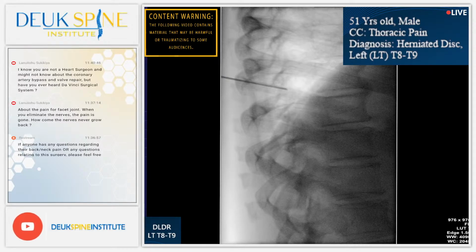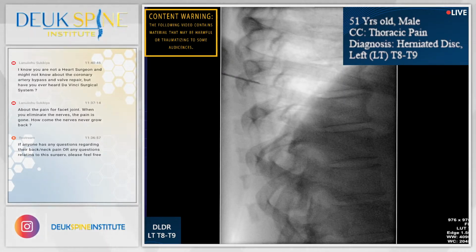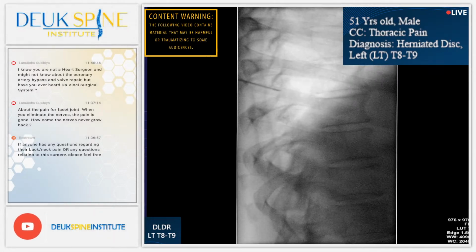So I'll try one more time higher. Again, bone.